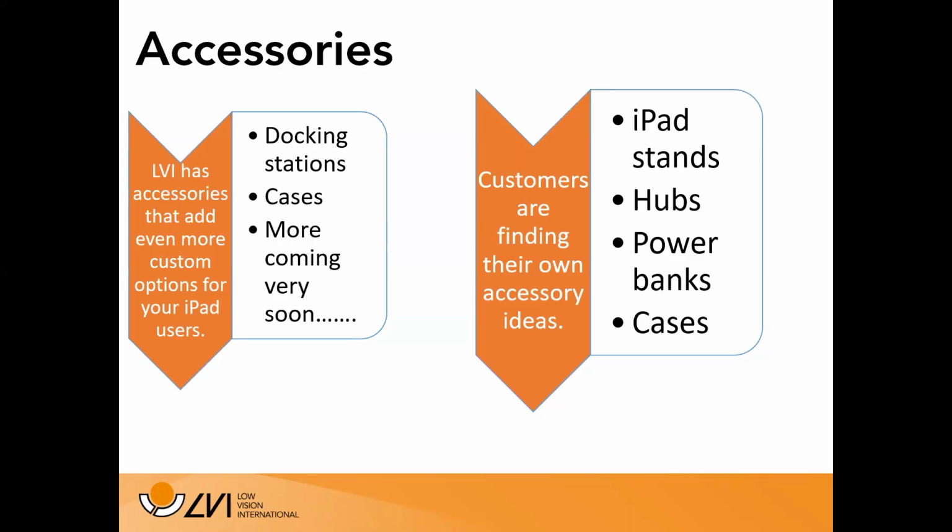It does fine with the near and distance without accessories, which is pretty cool. But there are some instances where it might be helpful to be able to insert that Magnilink Mini into a docking station or clamp it to a desk, much as you can do with the Magnilink S. And we are looking at that. Some other accessories that we see: there are about a hundred million versions of iPad stands. For different types of environments, these iPad stands can be a way to customize using an iPad and one of our cameras in a particular environment.